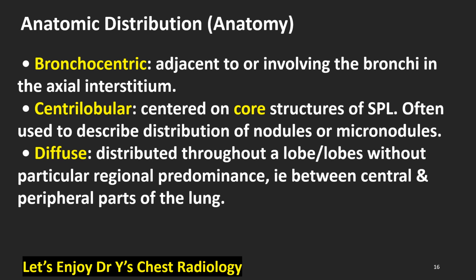Centrilobular, centered on core structures of secondary pulmonary lobule, often used to describe distribution of nodules or micronodules. Diffuse, distributed throughout the lobe or lobes without particular regional predominance, i.e. between central and peripheral parts of the lung.